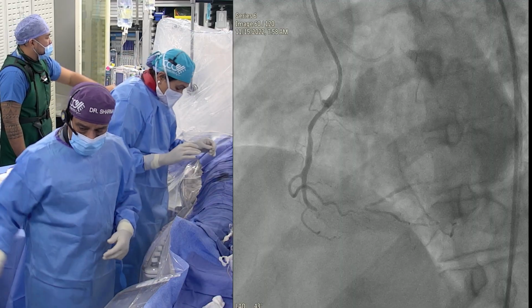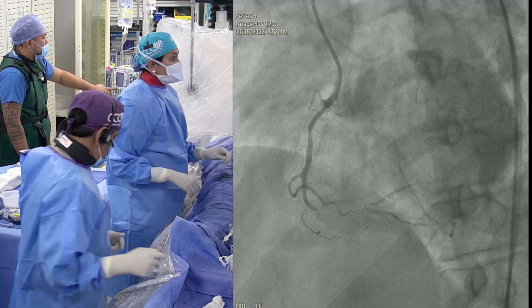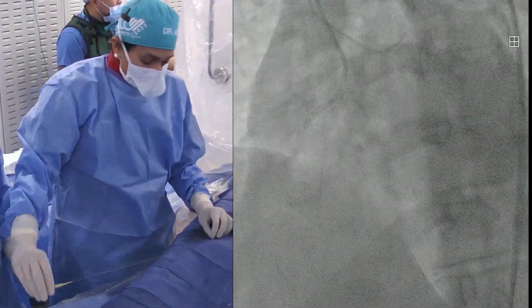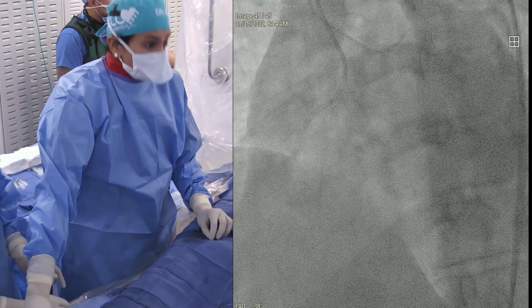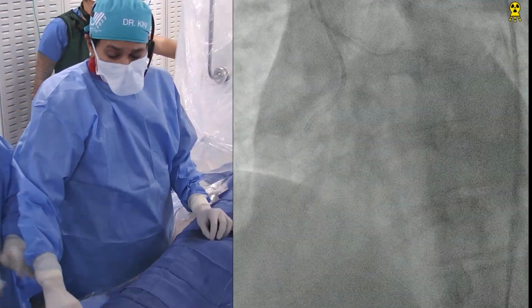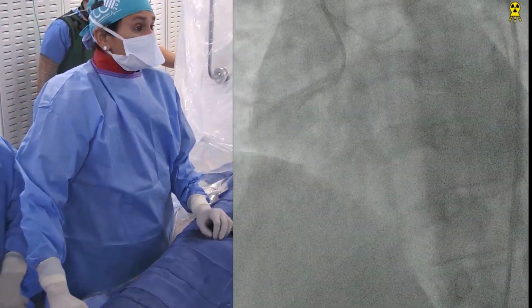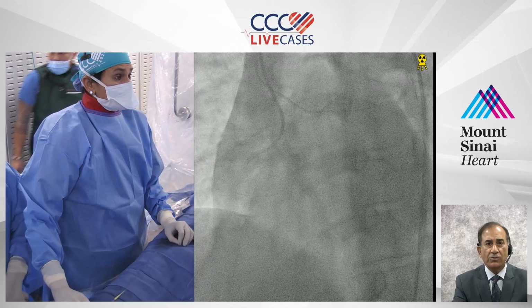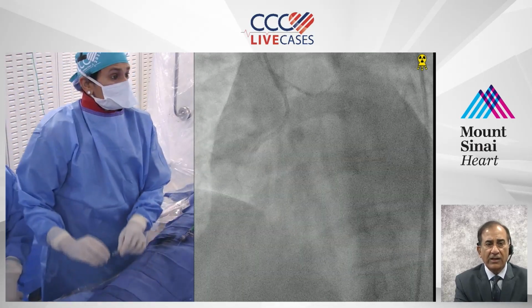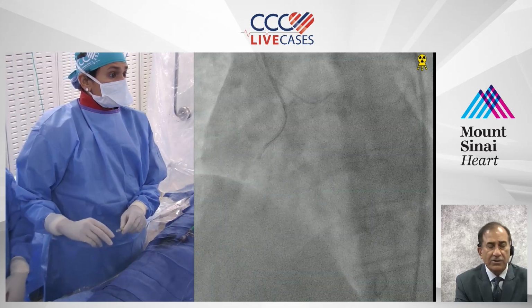So we have, all right guys, come LAO in. Yep, this is where we are, and I think we'll start. The microcatheter we are using is FineCross, and in the meantime, we could use any microcatheter. Before you go to the microcatheters and the wire, there are 2 questions coming in regarding the approach you're using and which guiding catheters you prefer.